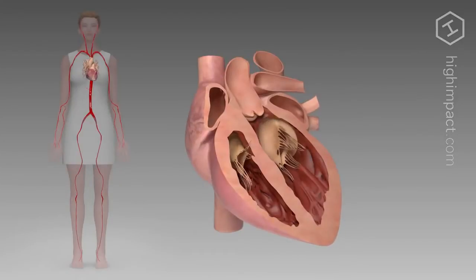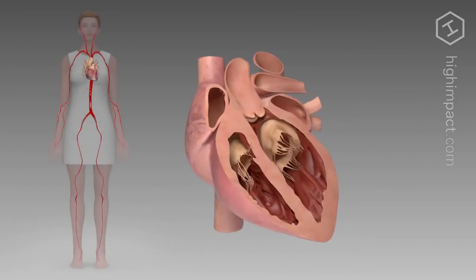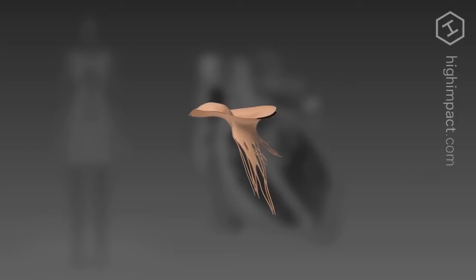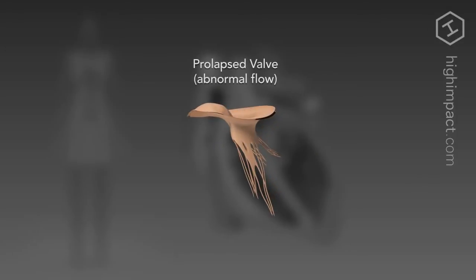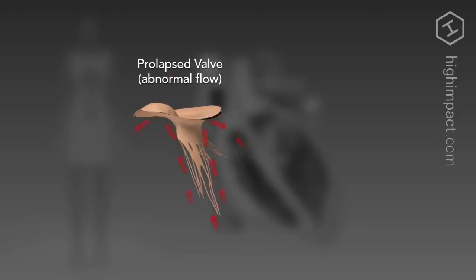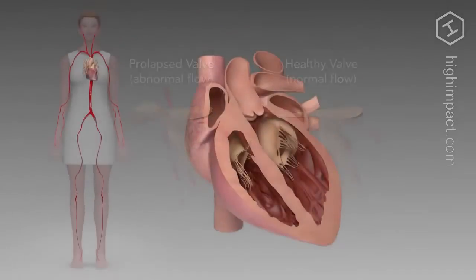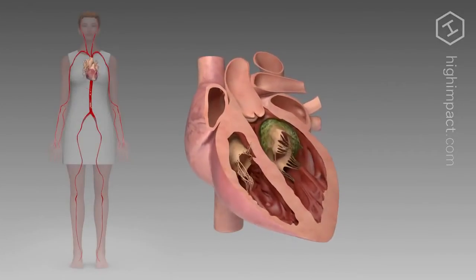What you are currently looking at is a healthy beating heart. What is now being shown to you is a prolapsed valve — it is prolapsed because of the vegetation on the left side. On the right is a healthy valve. As you can see, there is a difference between the abnormal blood flow and the healthy.